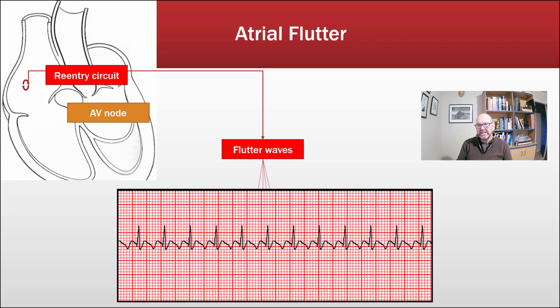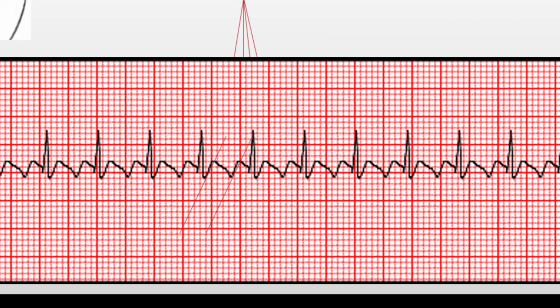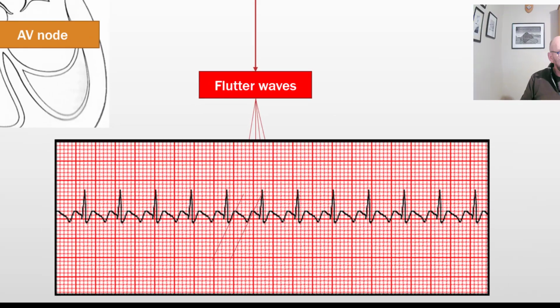Secondly, with any tachycardia that has a rate of around about 150, suspect atrial flutter as a likely culprit, and re-examine the atrial activity to see whether it has a steep upsweep, one that you would normally associate with a sawtooth pattern. And if there's two together that match, as is shown here, it's more likely to be atrial flutter.